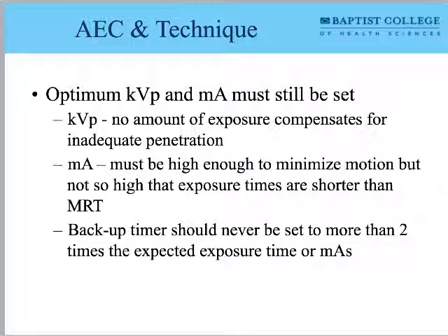So if we didn't have that set up, what would happen is we'd have the patient, maybe we didn't activate the right Bucky, maybe we activated the table Bucky instead of the wall Bucky, and we're doing a chest x-ray, right? So we're holding our finger on the button, it's going beep again, and it's not cutting off, and we're like, wow, this patient must be made out of titanium or something, right? Then it hits the backup timer and it cuts it off. Now here's the deep irony: when it comes to digital imaging, those pictures are going to look exactly the same.